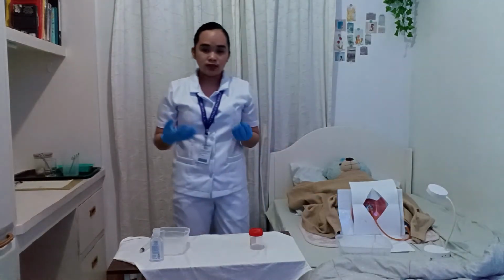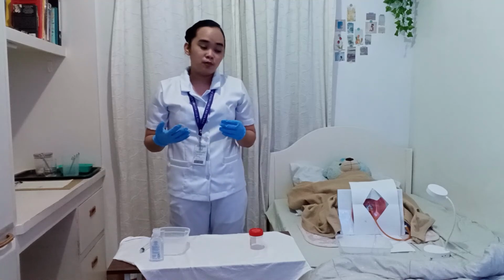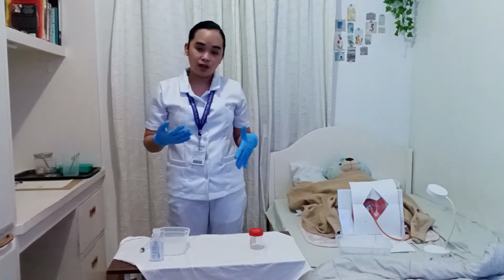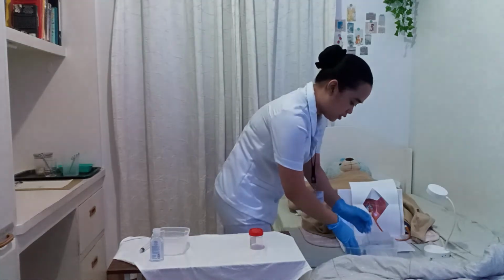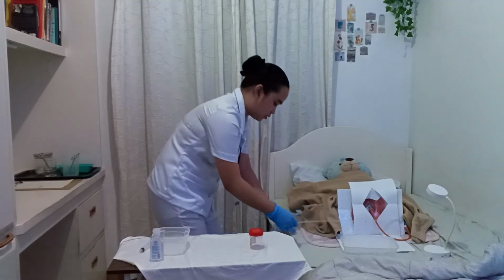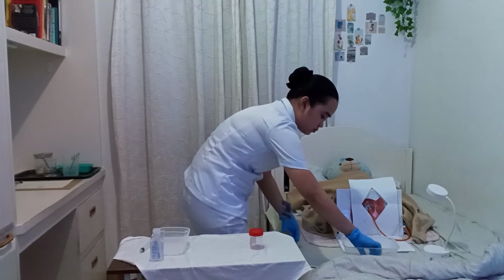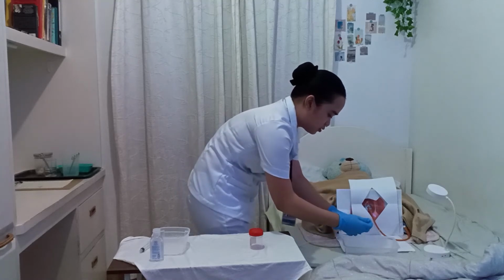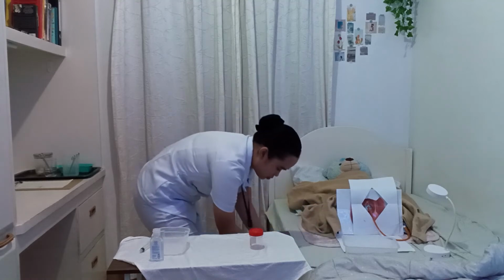So, now I'm going to place the urine bag on an unmovable area beside the patient's bed at the level below the patient's waist. So, I'm going to place this here on this side. Okay. Just going to take this one.